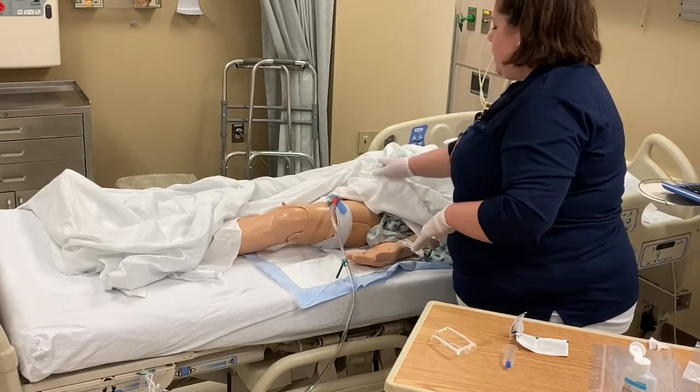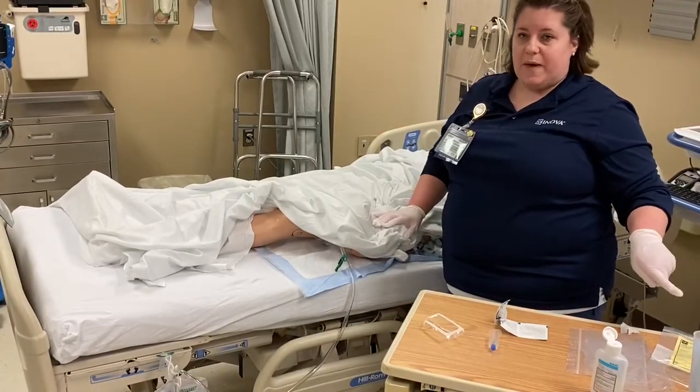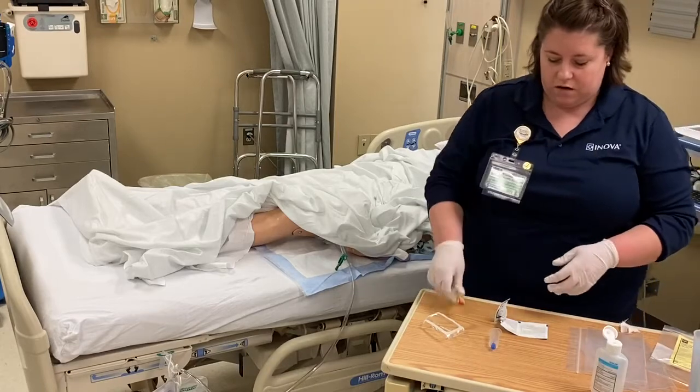So at this point, I'm just going to cover my patient up for a second because I want to come back over here to my specimen. All right, so I've collected my urine right here.